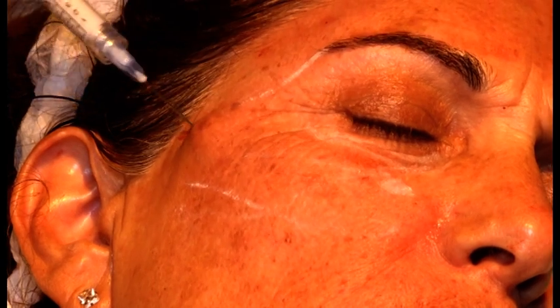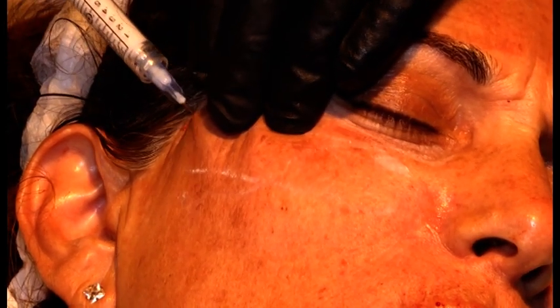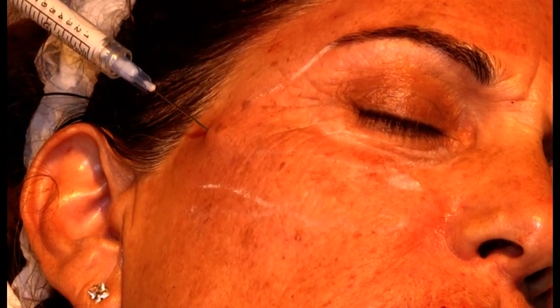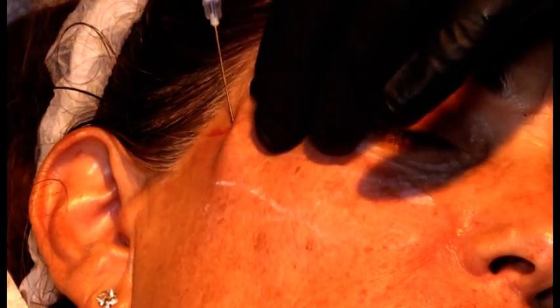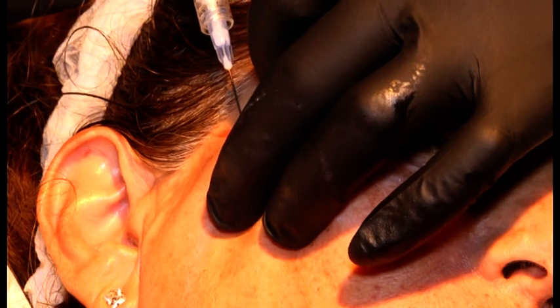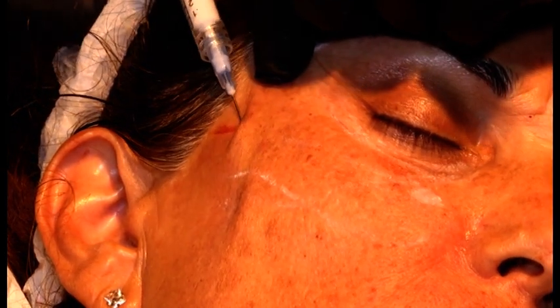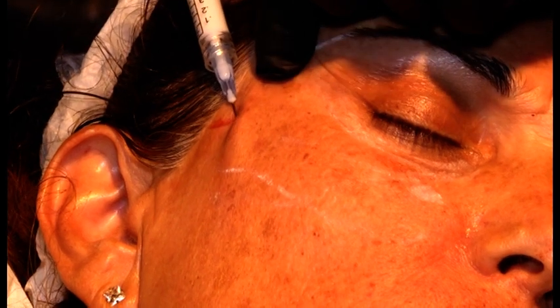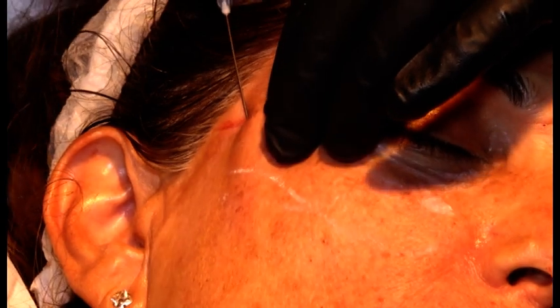I don't feel any resistance here, so maybe there's no more ligament. I go back. Resistance, retrograde. I'm also looking at the shape because it's not just the lift, it's also augmentation. So I move a little bit further laterally. And now click. And I pull up, bolus, retrograde.